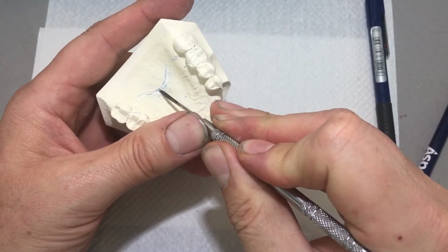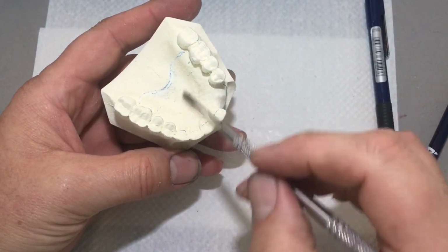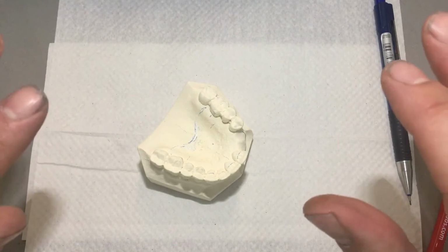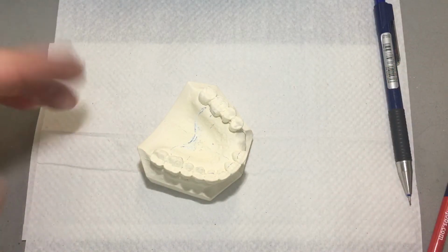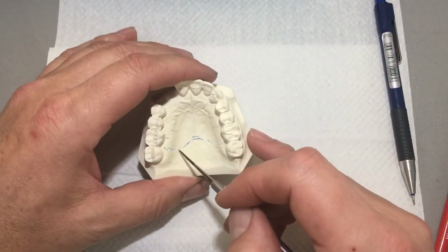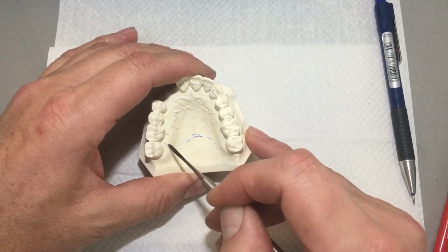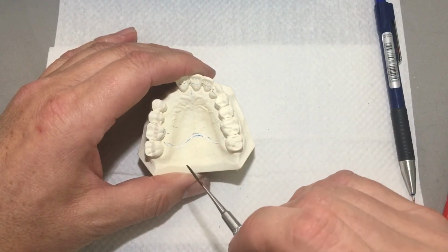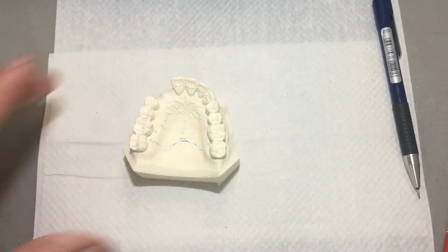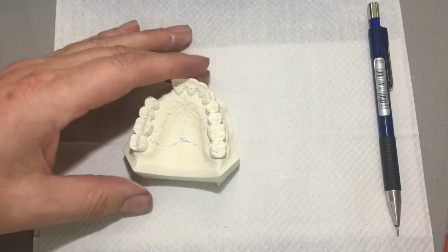And naturally, I'm sure you figured this out from the last project, the more acrylic that you have sagging down to the palate, the more shrinkage there will be. So the thinner you can apply the acrylic, the less shrinkage there'll be. So the secret in a prosthetic like this is in the dental technology. If you can apply it a little bit thinner, but not too thin that you have to add. It comes down to the same old adage, how much? Just enough.